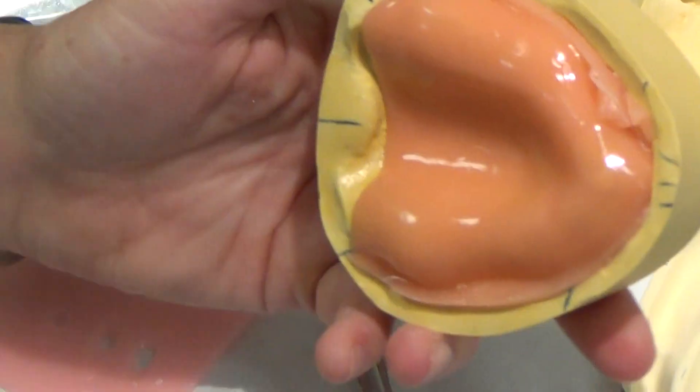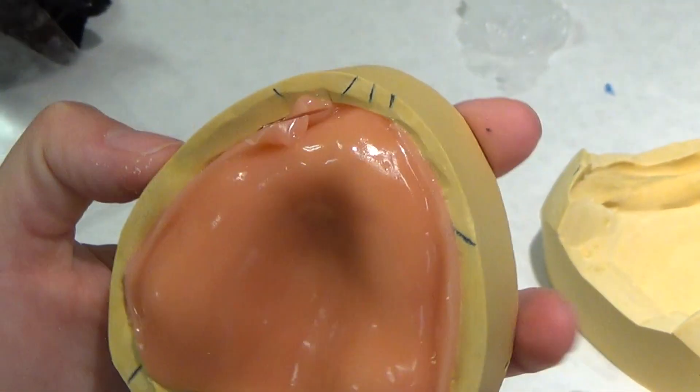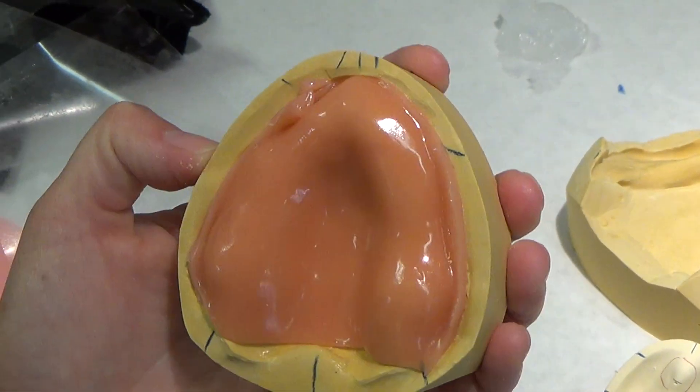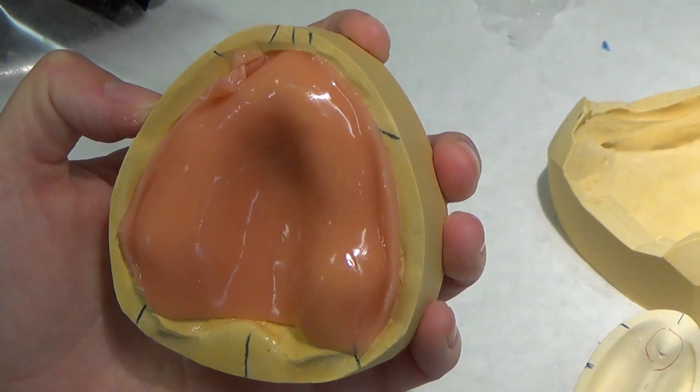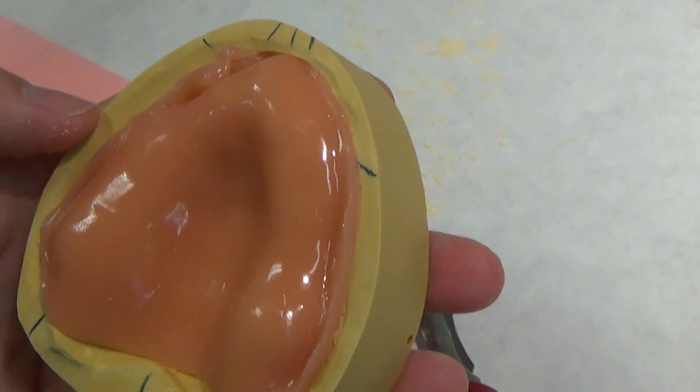Now I have this roll that is not exactly adhered to itself, but it's filling the depth of that vestibule. So now what I'm going to do is roll the excess up and thin it out a little bit.